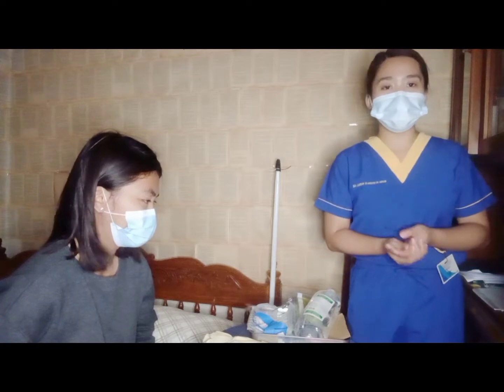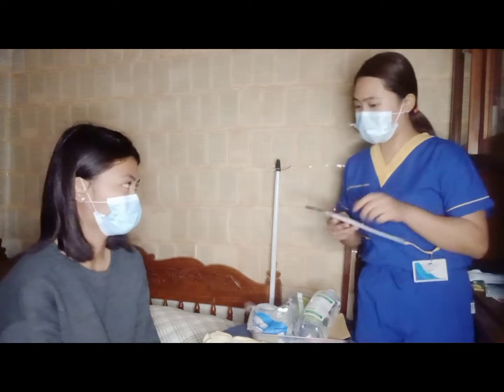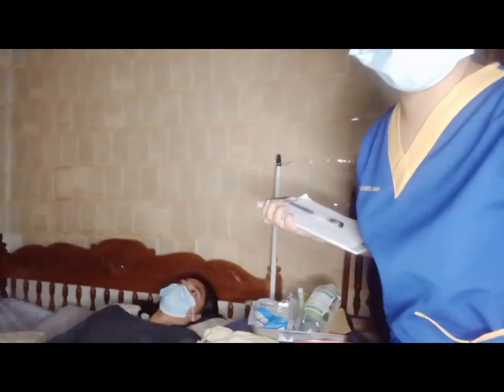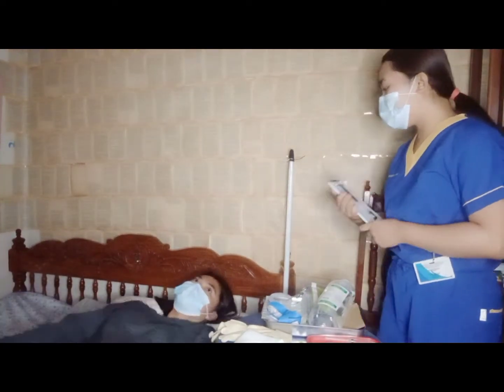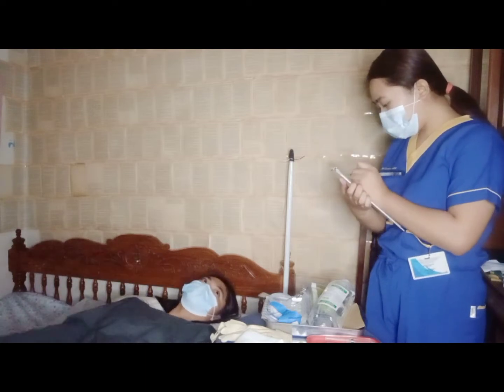Then, after that, let's check for the patient. Good morning, ma'am. I am Mika, your nurse attendant for today. Can you state your name, ma'am? Stephanie po, ma'am.